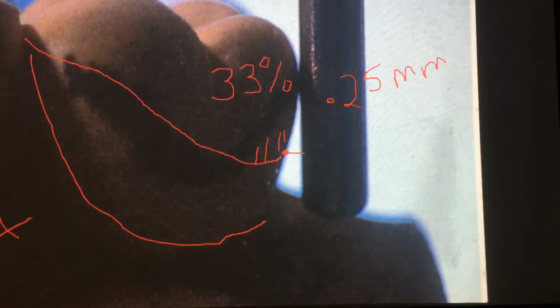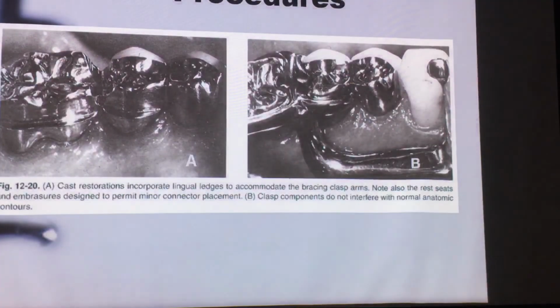Now, before discussing all the clasps, maybe I'll just discuss the one that we need, and then we'll backfill the information so we can keep busy today, possibly even go all the way and finish it off. One more reason for surveying is determining restorative procedures.